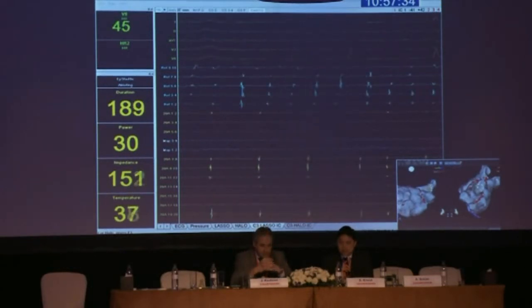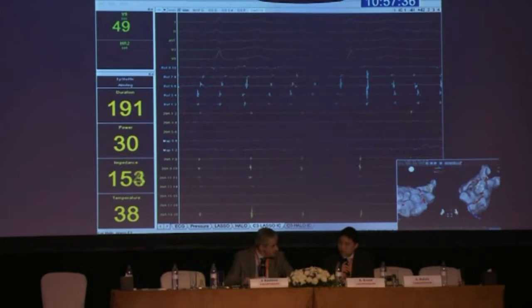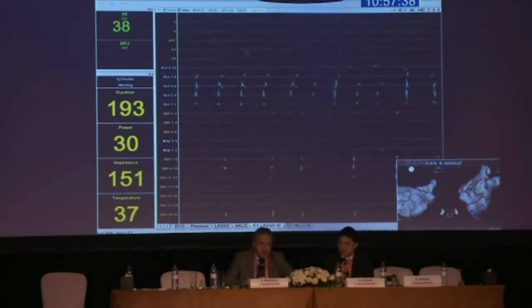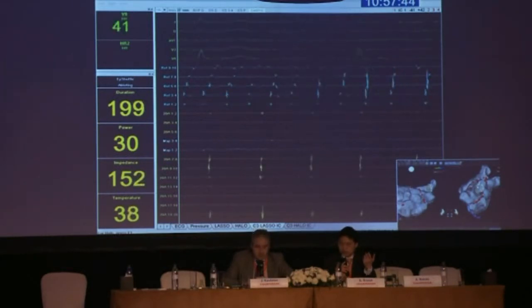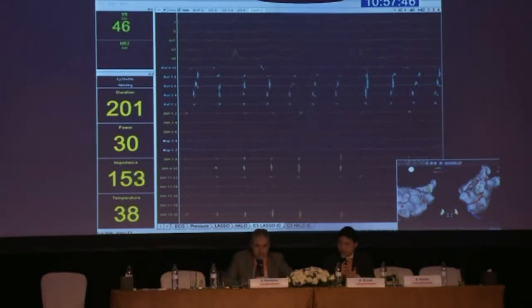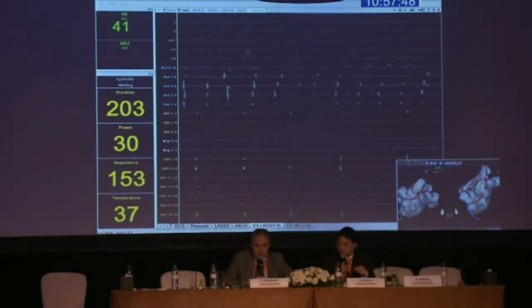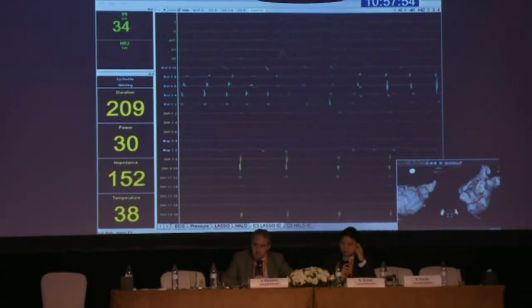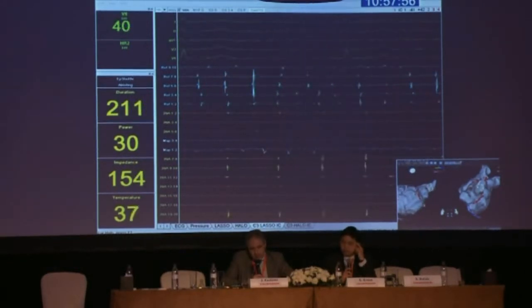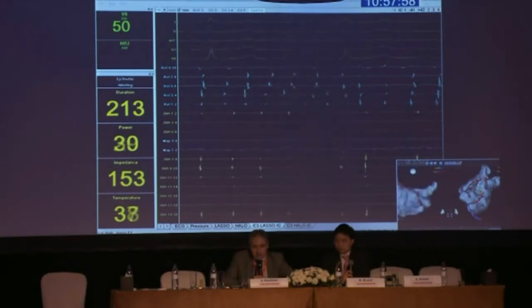And in the very early data from Bordeaux in segmental ostial isolation, it also depends on your lasso position. If your lasso is quite far in, you can ablate in remote areas that are not early, and yet you get PV isolation. No, I didn't mean segmental, I meant circumferential, but this happens sometimes incidentally. Sure. So my question was, what's the explanation? You have answered this. Thank you. Yeah, thank you.